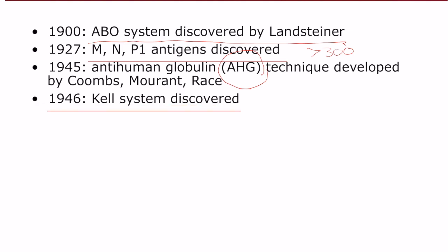One of the things I keep hearing over and over again with some of the podcasts and the extra education I do with blood bank is one of the mnemonics that's used for the KELL system. KELL is another one of those antigens on the outside of a red blood cell, so I'll just draw a little K on there. There's more than just big K in this system, but it is the most significant.